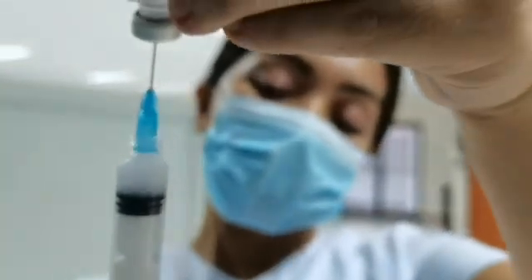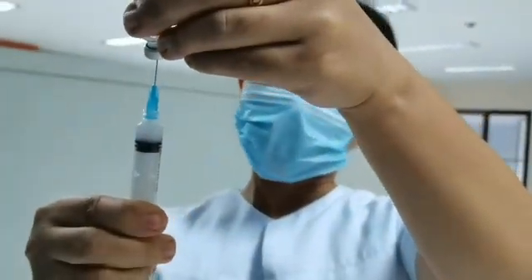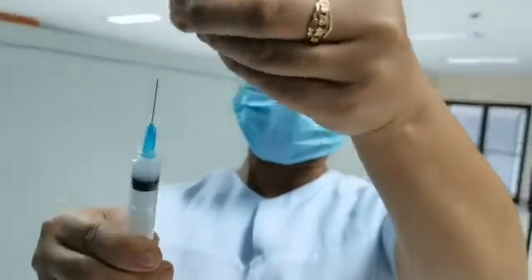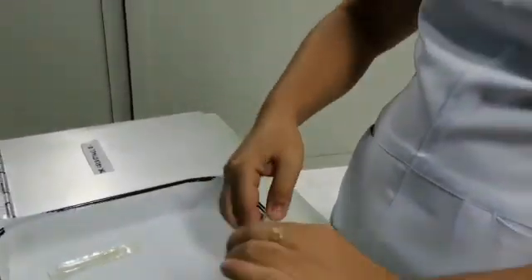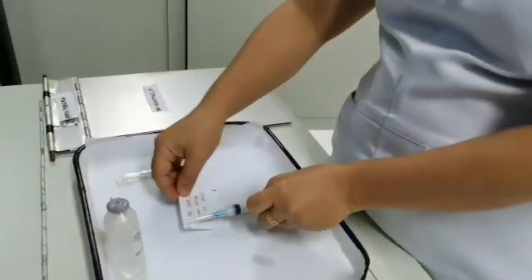Then hold the plunger, grip the plunger, so the medication will not be moved away from the syringe like this. Then do scooping technique, and then you are now ready to give your medication to the patient.